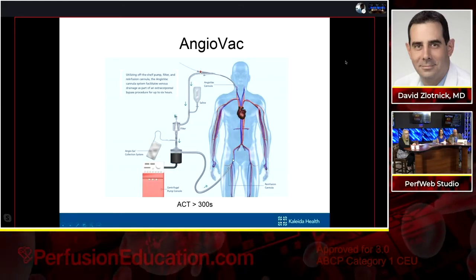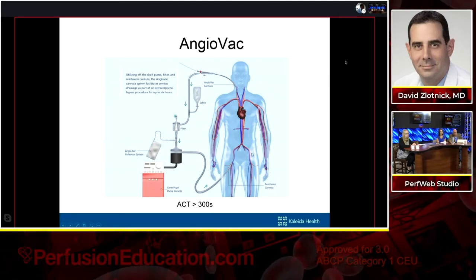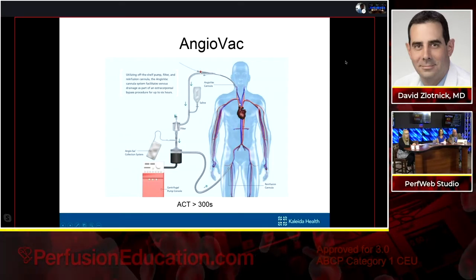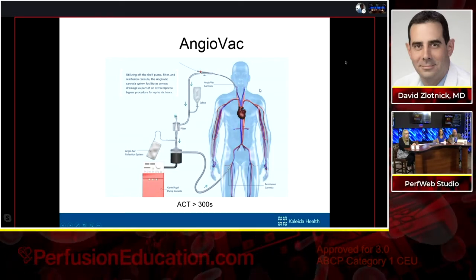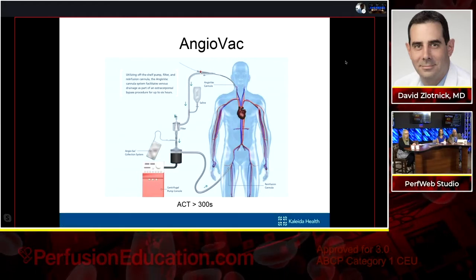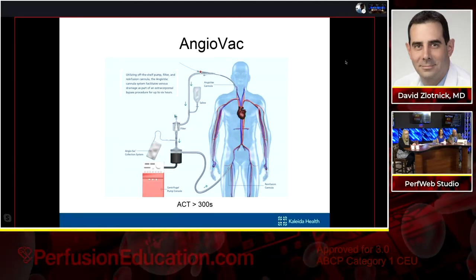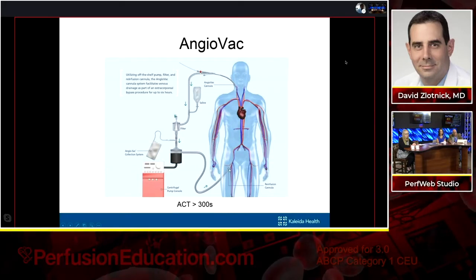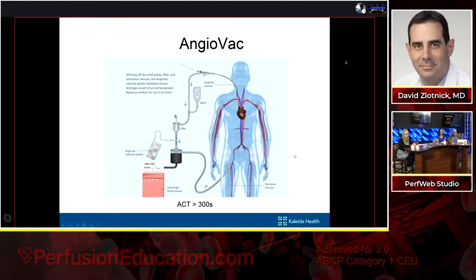The different arrangements that can be made: you can do femoral-femoral access. This is when we're trying to go after tumbling clot in the right heart, or if we're going into an SVC. You can even do veno-veno access through the bilateral IJ without having to go through the femoral vein. So realistically, you can utilize any combination of these access sites. And in the unstable patient, you can even splice VA ECMO into your return circuit so you can maintain hemodynamic stability, as well as providing oxygenation.